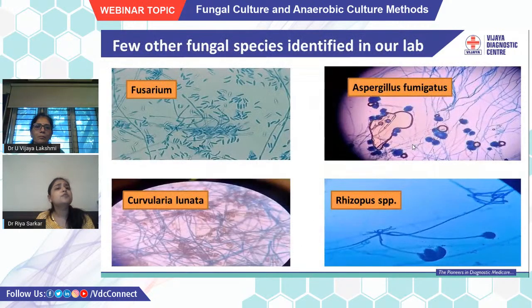Few other fungal species that we have identified in our laboratory are Aspergillus fumigatus, Rhizopus species, and from two corneal scrapings, we have also grown Fusarium and Curvularia lunata.